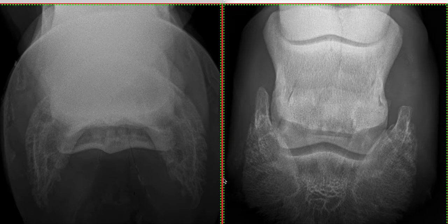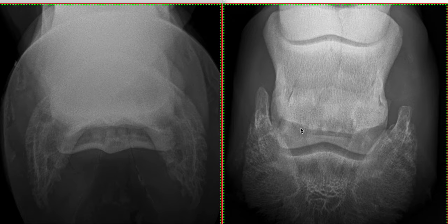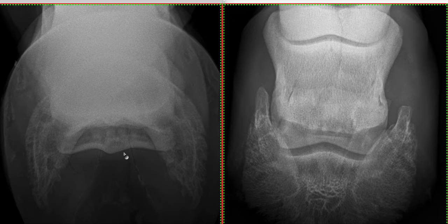So all in all, I think this navicular bone looks quite unhappy. I would say this has severe navicular disease based on the alterations to the synovial invaginations on the distal horizontal border and this lucency here, which I think represents a flexor cortex erosion.